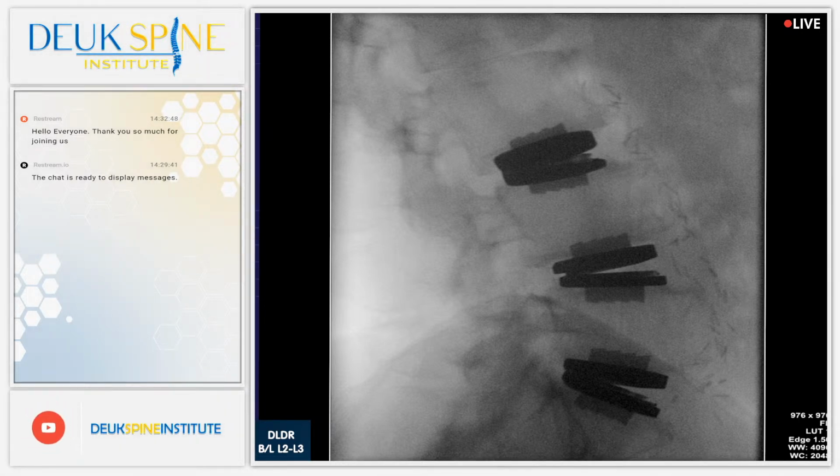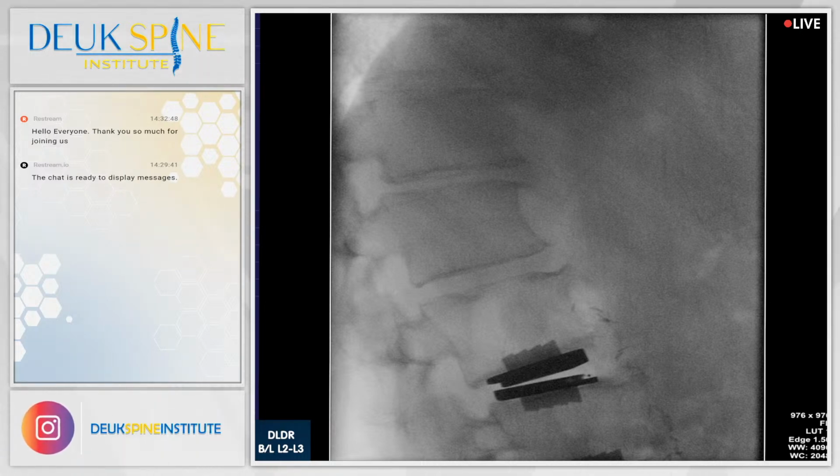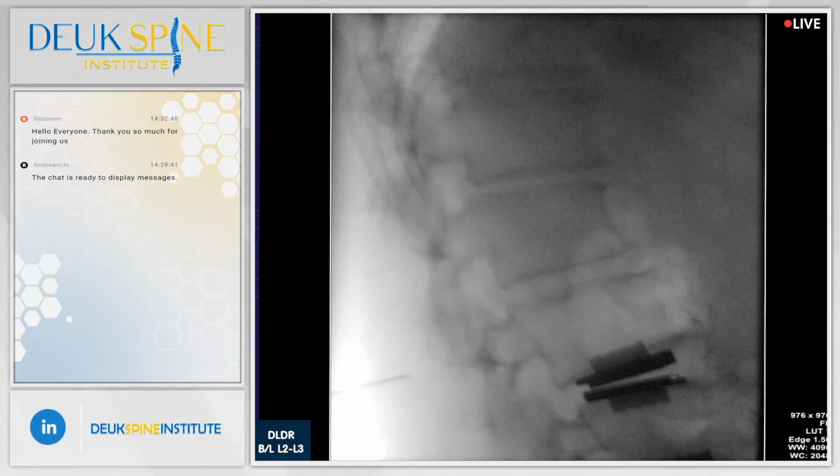All right, we're going to get started. Are you comfortable? Good. I need to fix the L2-3 on both sides, so let's get started. Shot. Let's just see where we are. Oh, very good. Let's drop the table. We're going to move up above the top Oreo cookie or artificial disc. That's perfect. Great job. Now I'm going to try to access the L2-3.